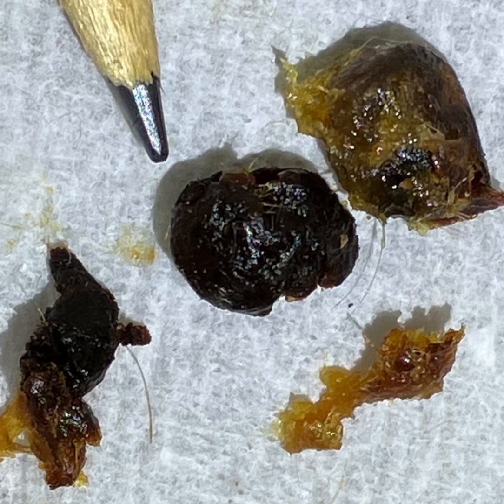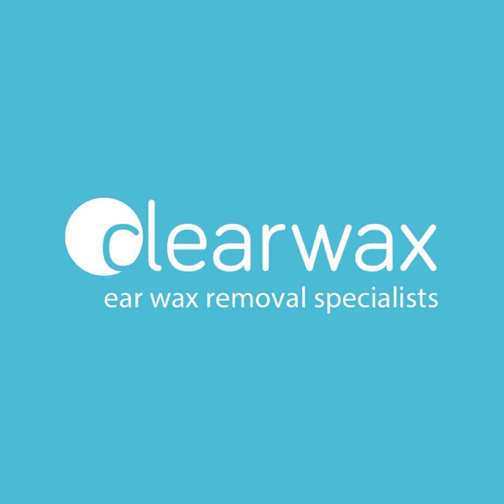We've referred them to a GP for treatment of their blocked eustachian tube, which is causing negative middle ear pressure in their right ear and the buildup of fluid in their left ear. I hope you enjoyed that video, and if you are interested in the Waxscope, please email info@clearwax.co.uk. Thank you.